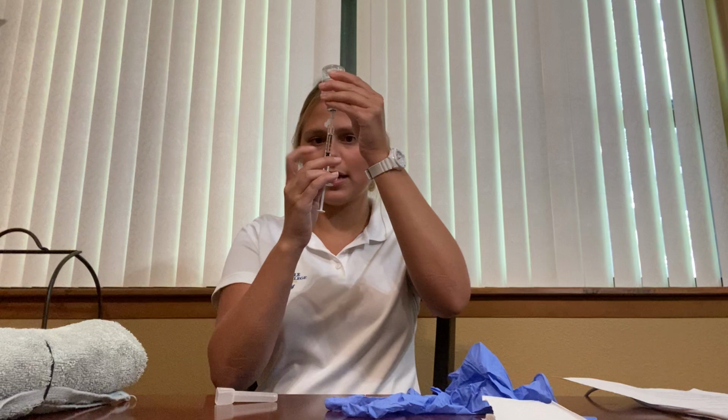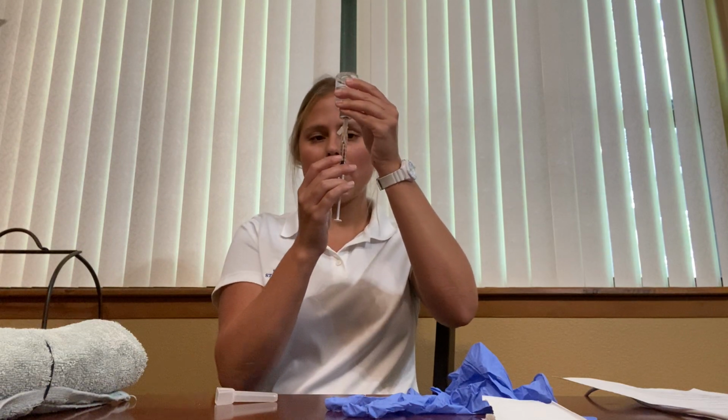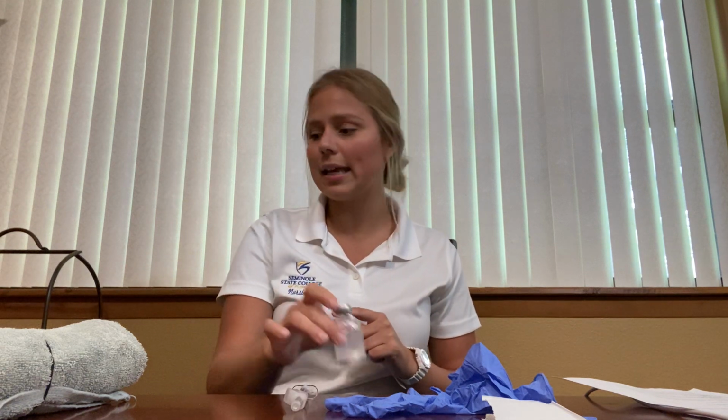Okay, and then I would tap it, any air bubbles or anything to go to the top. Okay, make sure I actually have the right amount, 0.5 mLs. Okay, then I'm going to safely cap my needle using the one hand scoop. Okay, and then I would label my syringe with the barcode. Okay, I can get rid of this.